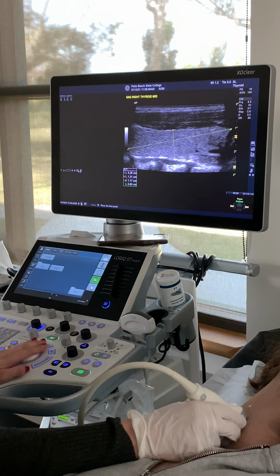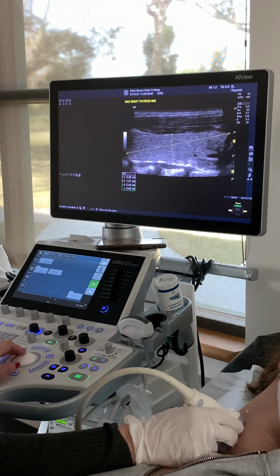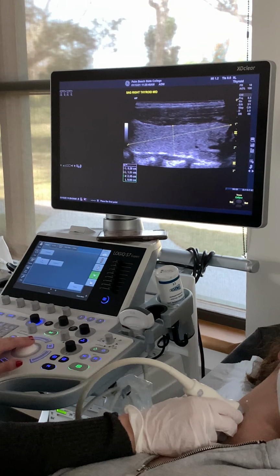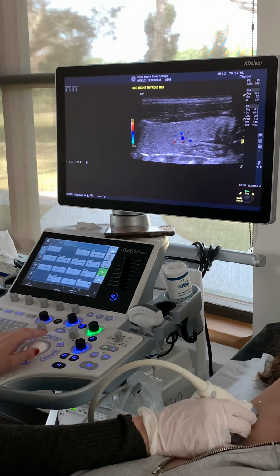This has a little bit of striations in it. So you can always just look where you can definitely see it and just kind of follow your thyroid tissue around. Even if you're going diagonal across it like that? So I'm just measuring from tip to tip. Okay, right here is the longest tip, and then right here is where it comes out the furthest. Okay. And then you're gonna do your color picture.